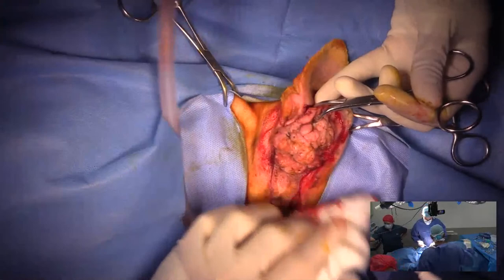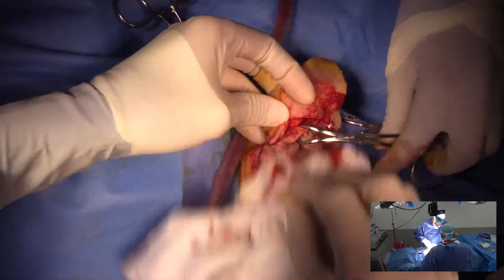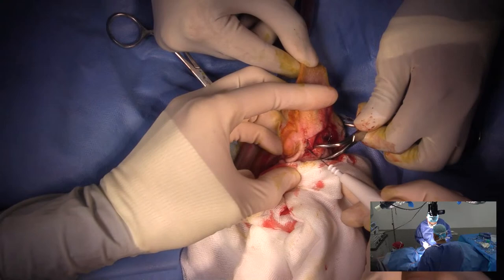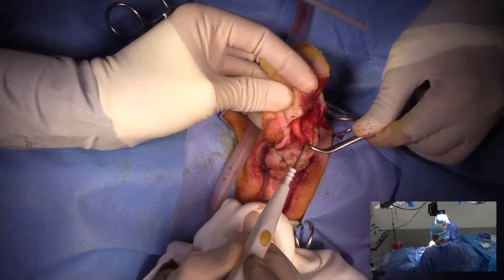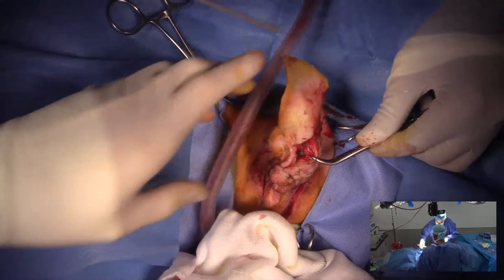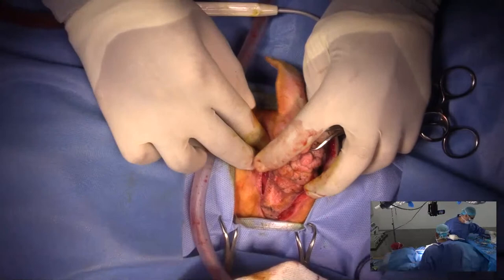So there's a question about whether it's been biopsied in the past, and it has been biopsied, and it came back just polypoid hyperplastic inflammation. In the beginning of this surgery is actually the trickiest when you're trying to establish that plane of dissection around the ear canal, around the external opening of the ear canal. I find that to be really tricky.